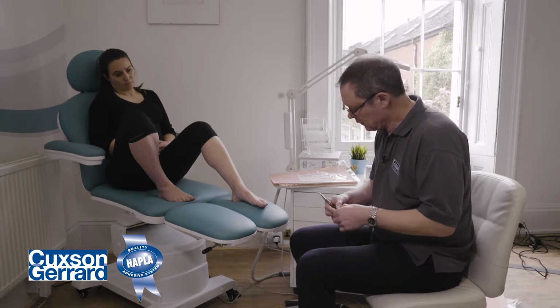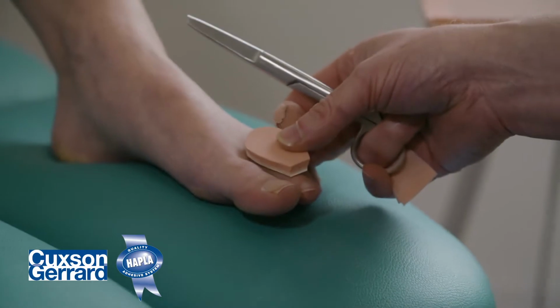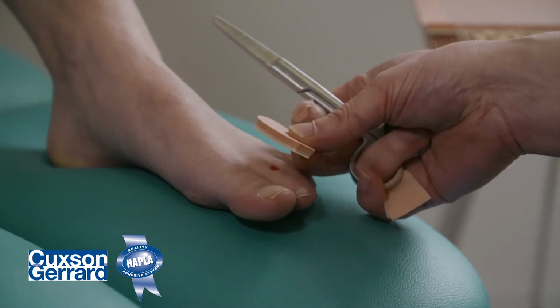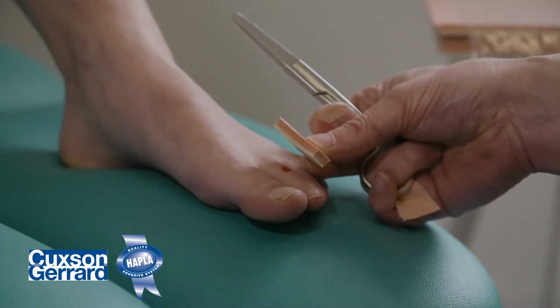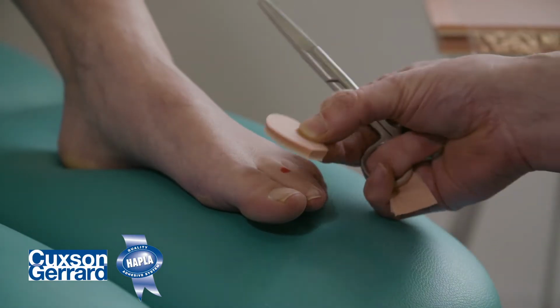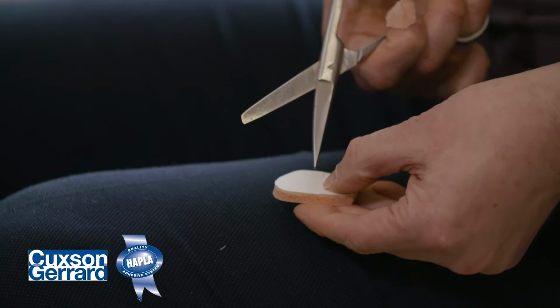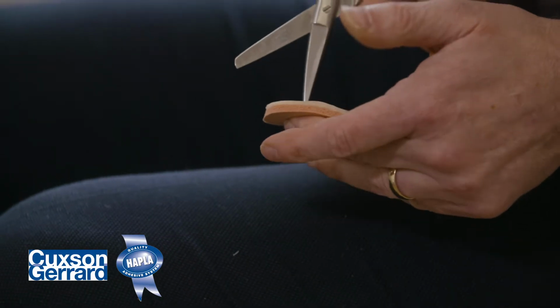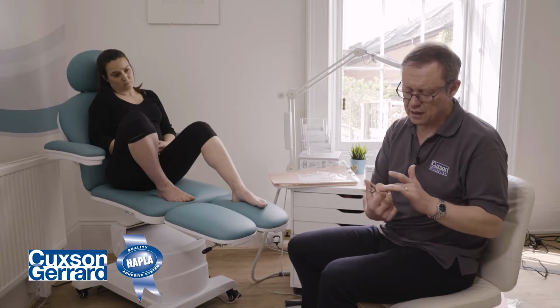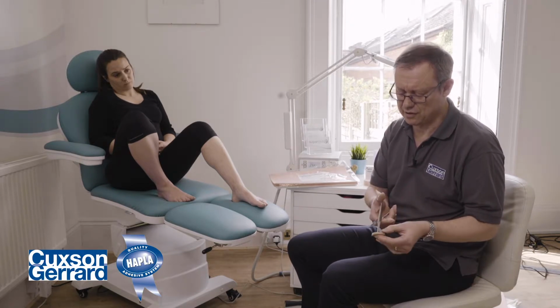Now, with the wider portion at the back and the narrow portion at the front, we're going to then just find out the area that we need to make our cavity directly over, which is signified by the red dot here, the lesion, so probably central about there. And then with the sharper part of our scissor, just pierce in slightly through the felt. Obviously, we don't want to go all the way through, so your finger will feel a slight bulge as the point pushes into the foam.